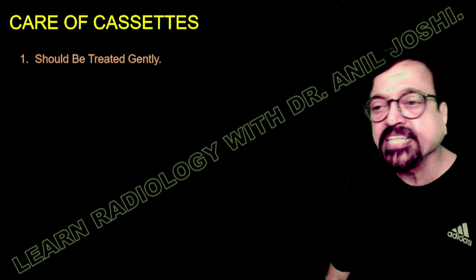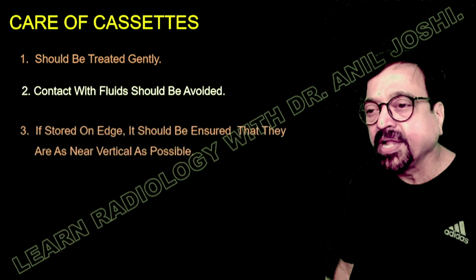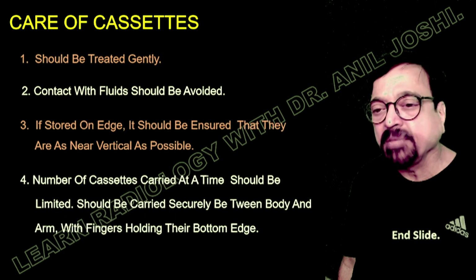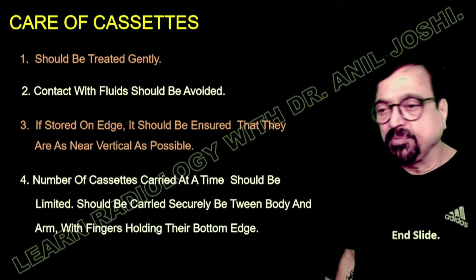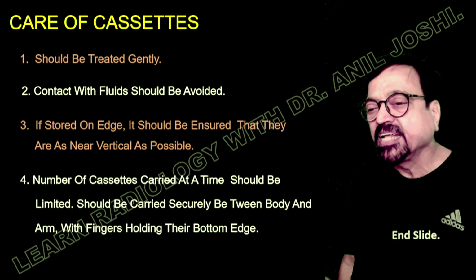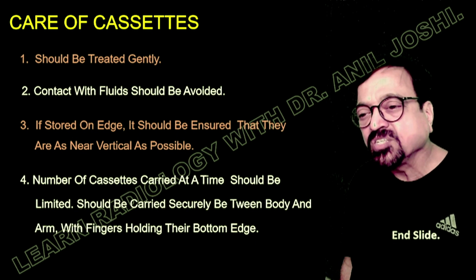Then, care of the cassette: it should be treated gently. Contact with fluid should be avoided. If stored on edge, it should be ensured that they are as nearly vertical as possible. The number of cassettes carried at a time should be limited, and they should be carried securely between body and arm with the fingers holding their bottom edge. These practicals we have covered in our video series on radiography.